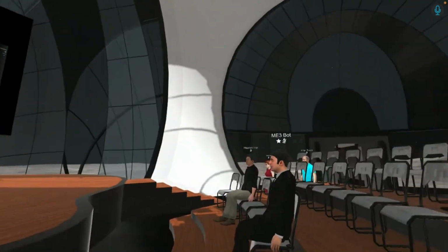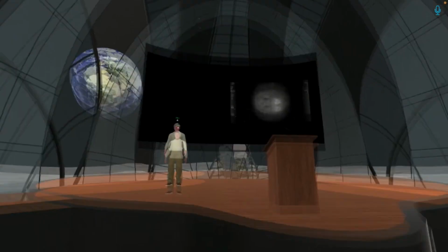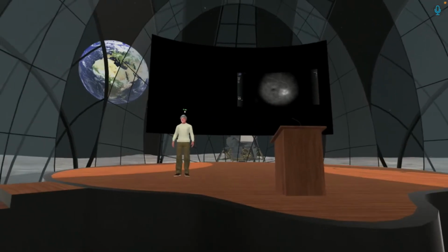So we're certainly all learning. The other thing that's really striking is the staining of the vitreous with fluorescein. I think that's great. That's really amazing visualization. Lukan, how much fluorescein are you putting in the vitreous so that you can see it?